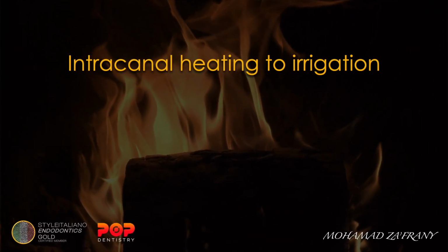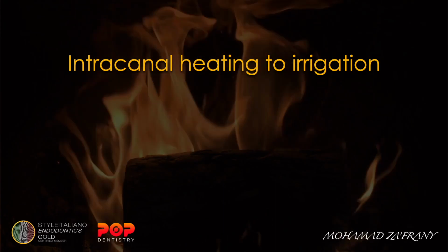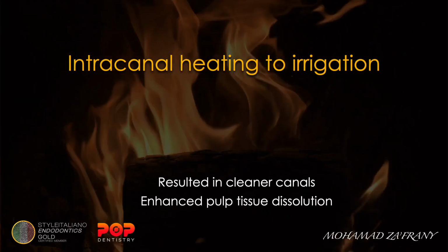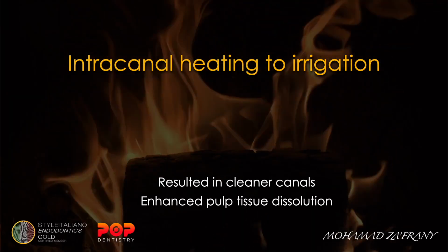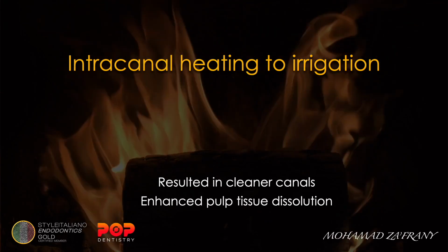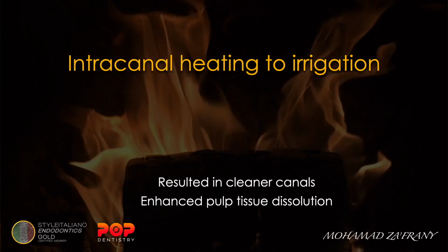Before showing you how we manage this case, I want to describe to you also the intracanal heating of irrigation concept. Studies already proved that warming sodium hypochlorite inside the canal enhanced pulp tissue dissolution and resulted in cleaner canals. Other studies showed that a final irrigation protocol based on intracanal heating of sodium hypochlorite at 180 degrees with the System B heat source proved to be better than preheated sodium hypochlorite at 50 degrees in obtaining cleaned canal walls.